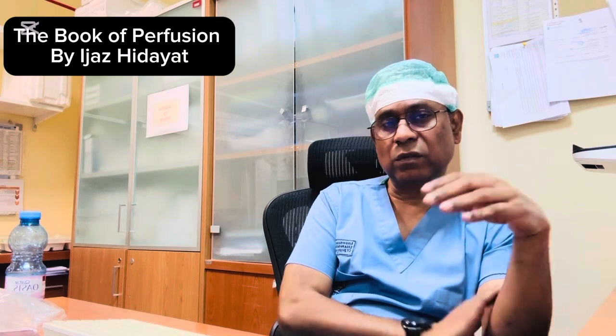The ECPR can be inside the hospital and outside the hospital. So if there is an inside the hospital ECPR activation, like you are in the operating room and ECPR is activated, you have the trolley. And in the hospital, you can move this ECPR trolley to the ICU, OR, cath lab, SDU, HDU, critical care areas. But if your patient is out of the hospital, then you always prepare your retrieval bags.